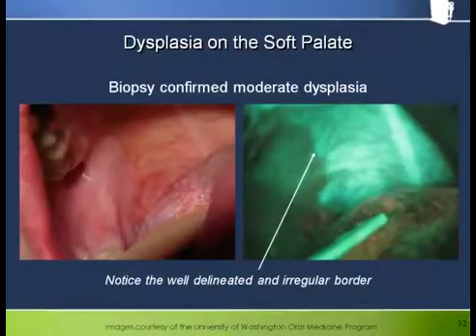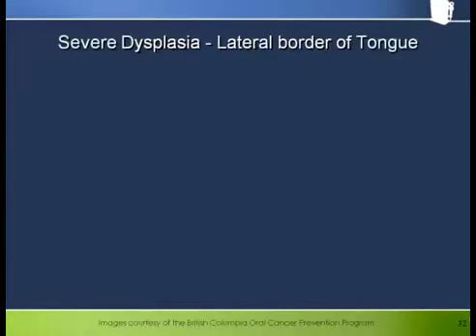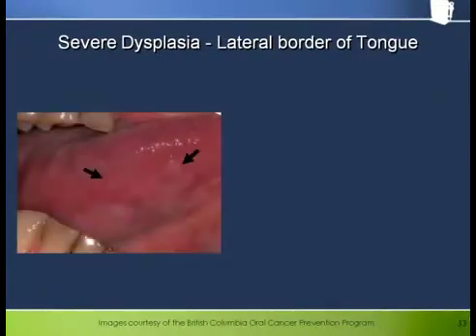This is a good example of how a white keratinized patch, despite the presence of keratin, which fluoresces, can look dark through the VELscope because of the underlying mechanisms of loss of fluorescence from both the decrease of FAD in the epithelium and the breaking of collagen crosslinks in the connective tissue. Notice how these effects reveal the same lesion morphology as in white light, although thrown into a much starker contrast.